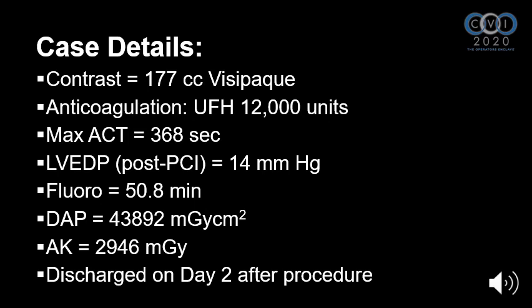The case details are shown here. 177 cc's of Visipaque contrast was used during this case, and the post-procedure LVEDP was 14, which we were very pleased with. The patient actually did extremely well and was discharged on day 2 after the procedure with no complication and with excellent healing of bilateral common femoral arterial access sites.